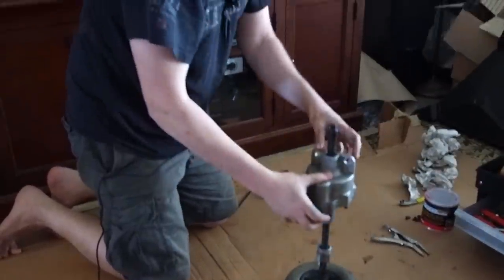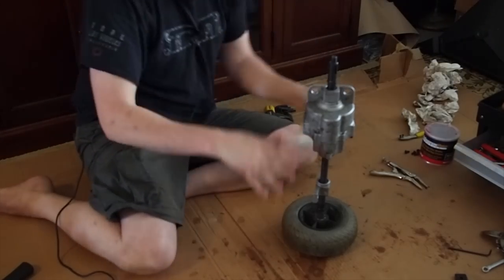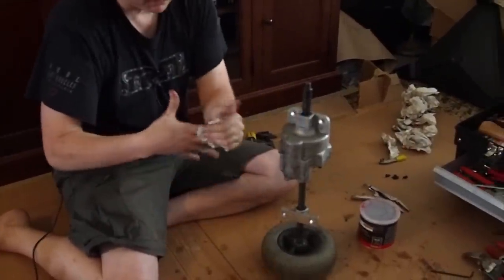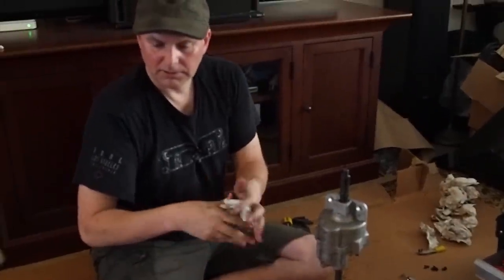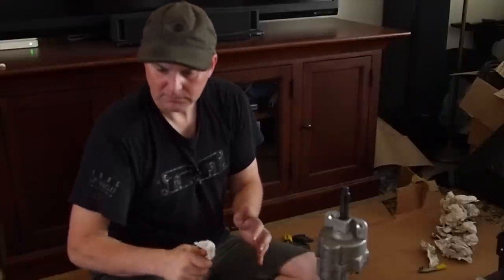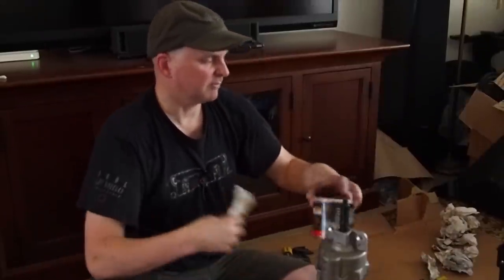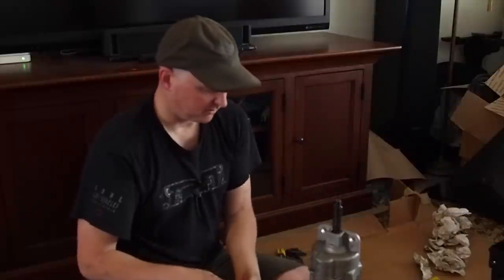Okay, so I think that this is the proper way to build it, or very nearly close to the proper way to build it. I'm going to go with this. So I'm going to take this apart one last time. I have some grease. I'm going to put some more grease in because I've taken a lot of the grease out in my hands. Pack it pretty full with grease. There's no reason why not to. Do you want to have air pockets in there? Not so much. It's just to keep the whole thing lubricated. So when they say pack it with grease, they mean it. And the grease, sooner or later, it compresses and goes down, so it does lose a bit of its volume over time.